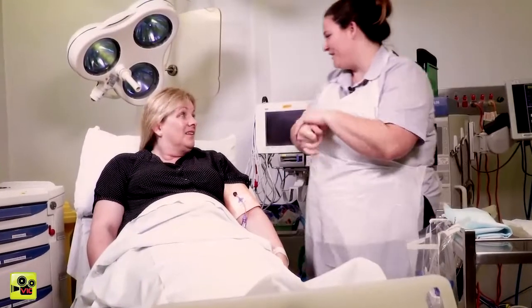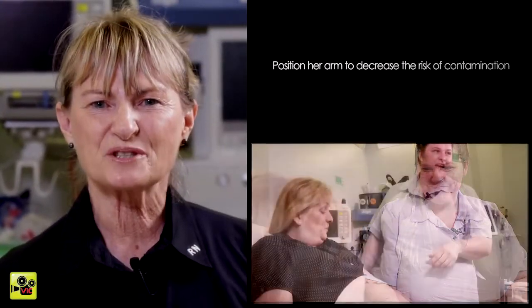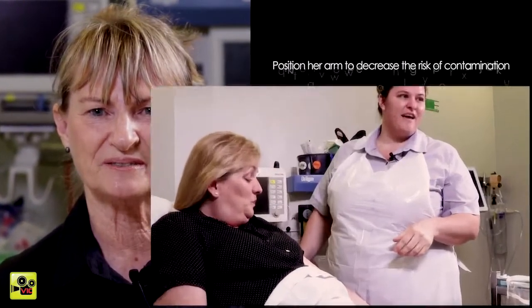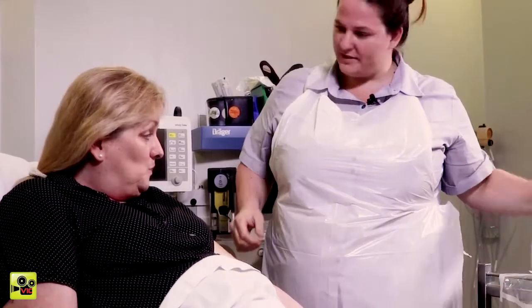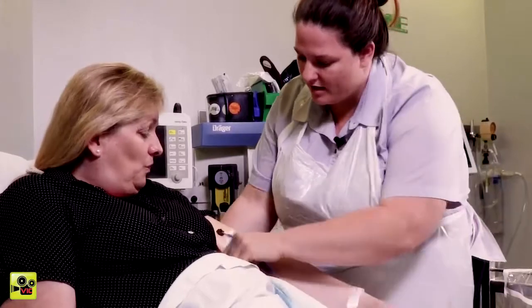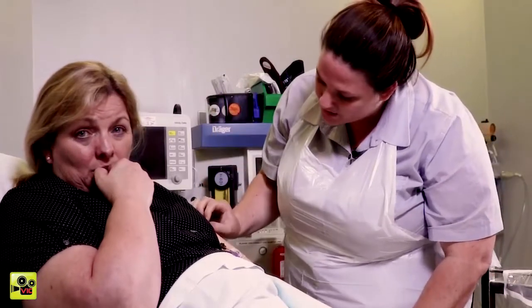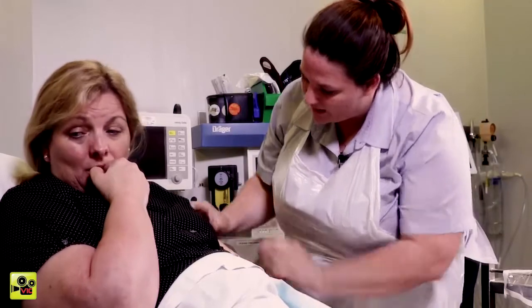Hi Vic, I'm Jane, one of the nurses. I'm going to do your PICC dressing now, is that okay? That's fine. I've just got Nurse Kathy here. She's going to watch me do the procedure. Okay. Position her arm to reduce the risk of contamination. Vic, I'm just going to put this plastic sheet under your arm. Now, if you can just lie your arm there, and then if you can look to the side for me to try not to breathe on the PICC line.